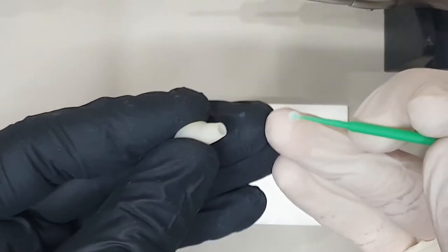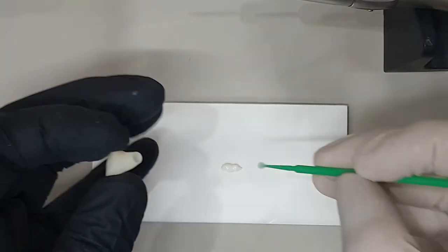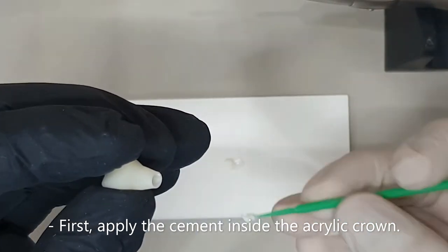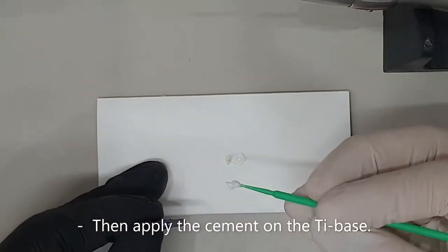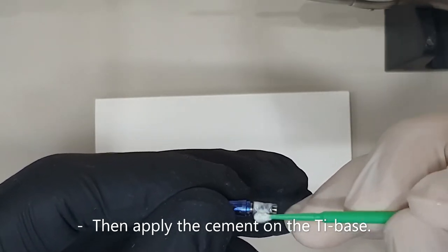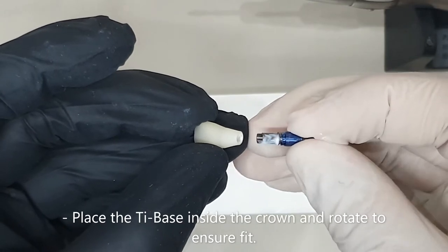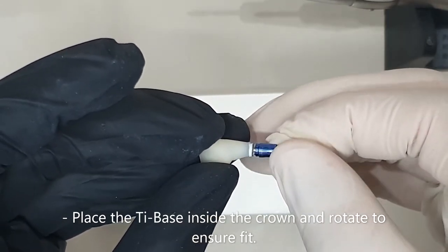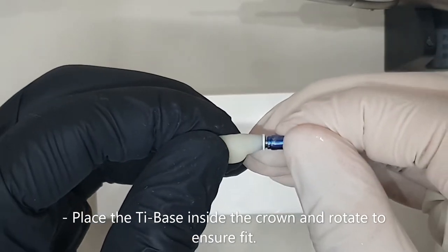I'll start by placing a little bit of cement inside of my acrylic crown. Now I'll place my titanium base inside of my acrylic crown and rotate until my ti-base clicks in place like this.